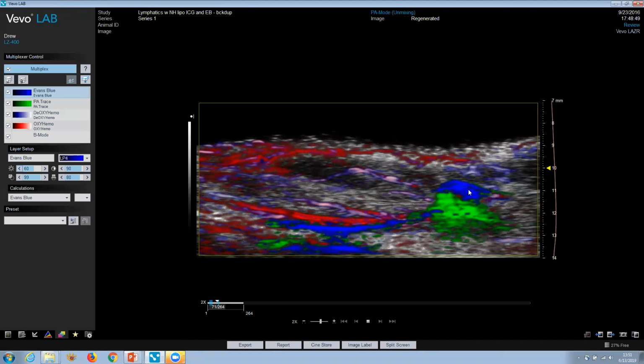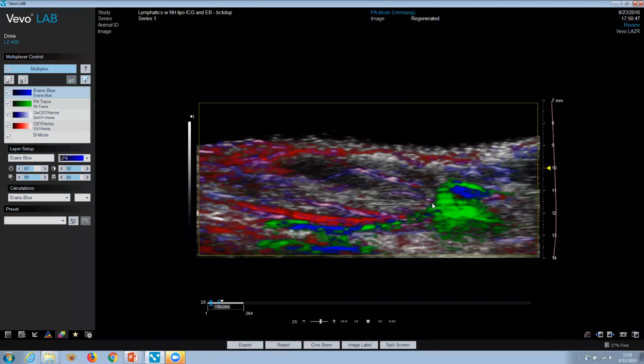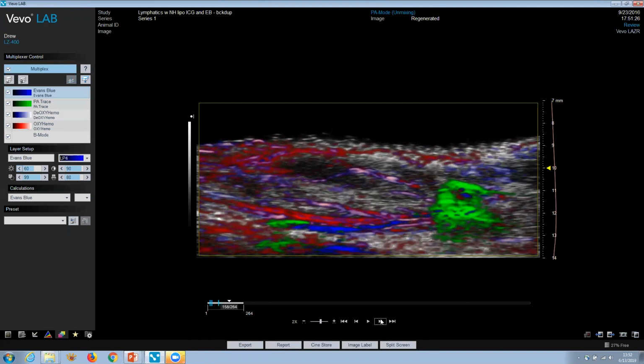You can see the signal going up initially and then going down, versus the nanoparticle, which is accumulating. You can even see little pockets of contrast agent being pumped through the lymphatics, and it's just accumulating in that lymph node there. Yeah, you can see things flowing in there. Sorry, I just thought that was neat.